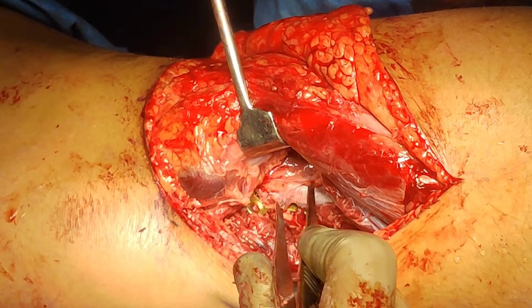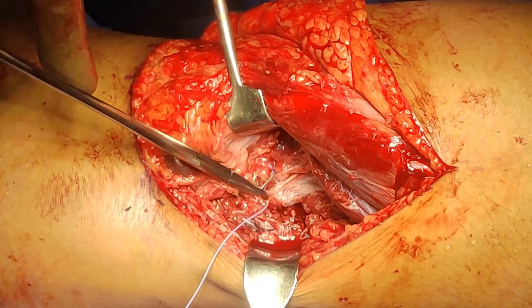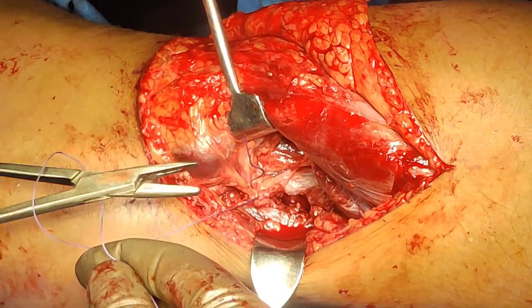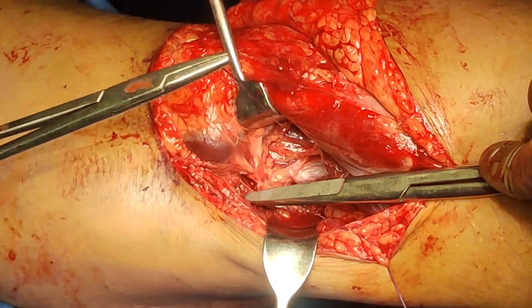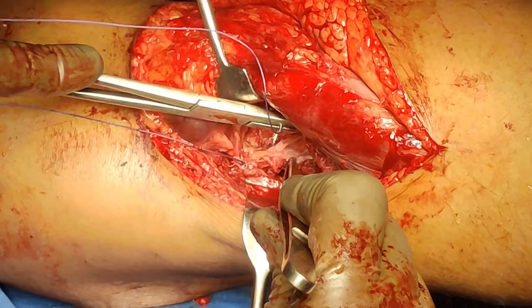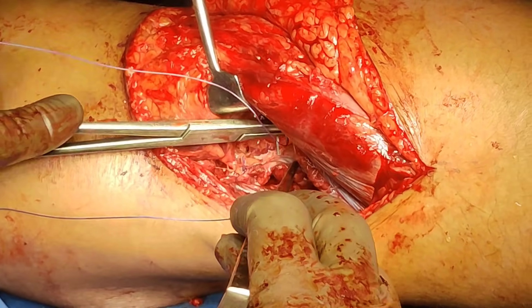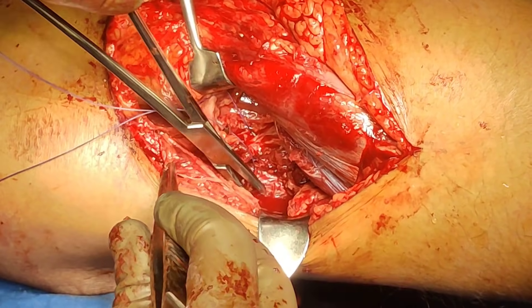Now comes the important part. This is our plate, and this is our popliteus and soleus complex. You need to reconstruct whatever you have taken off — that is the sign of a good surgeon. Whatever you have reflected, try to reconstruct it back, and you can do it only if you have a good understanding of anatomy and if the dissection was in a good plane. What I am doing is just approximating the epimysium — I've just left a layer here and I'm running a continuous suture, keeping the knee slightly flexed to help with closure.